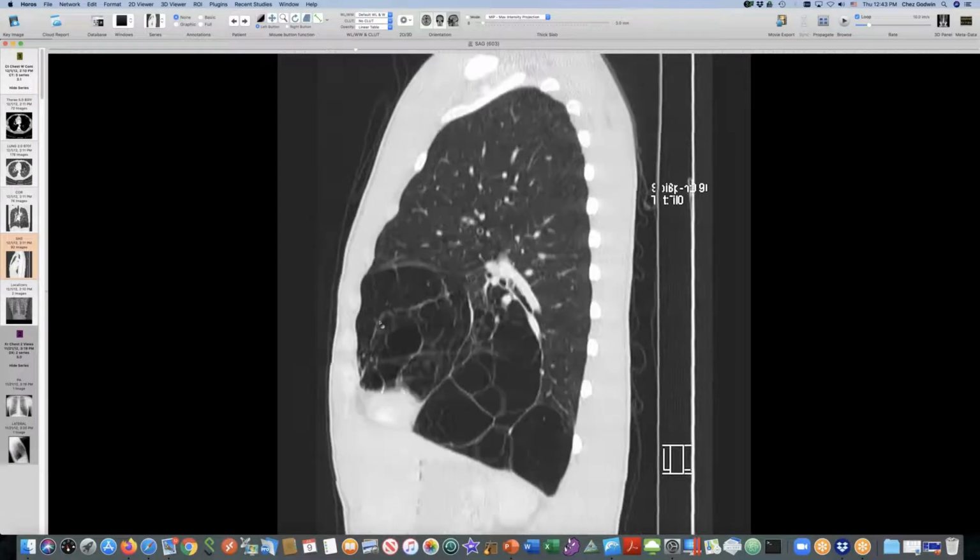So a very nice big CPAM. And the guy is currently in the hospital. This case came back from this imaging, I think was from 2012, but the guy's in the hospital because of a perforated duodenum. So we've seen his radiographs again, combined with a lot of acute abnormalities in his chest because of his bad abdominal problems and his surgery.